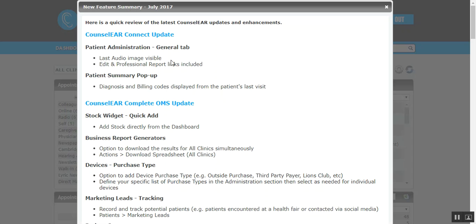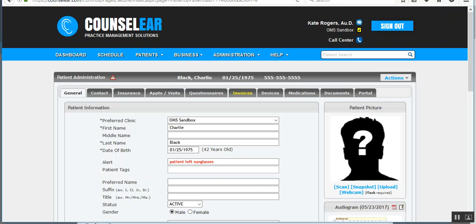So in the patient's administration screen, there's now an image where you can see the patient's last audiogram, along with links to edit and view the professional report. There's also an option to view the diagnosis and billing codes via the patient summary pop-up. So let's have a quick look at those first.